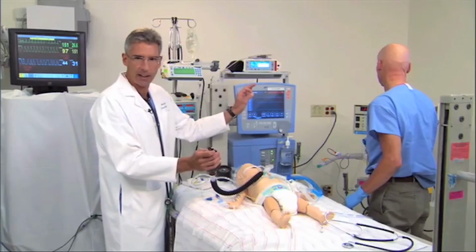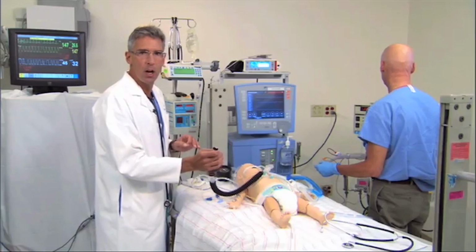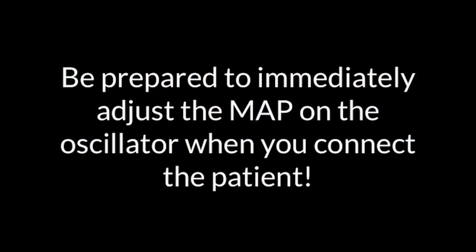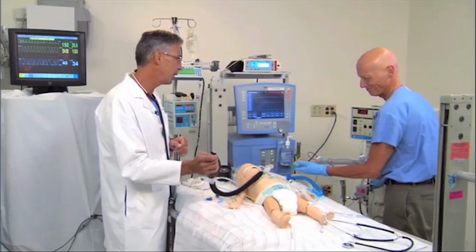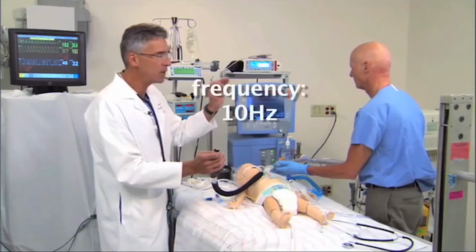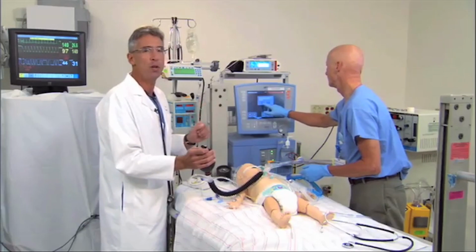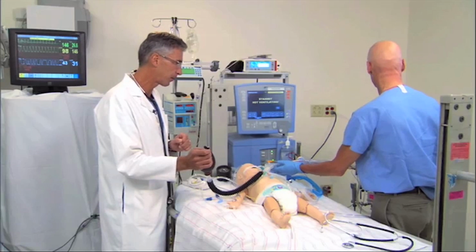Now remember, you can set the ventilator up, but as soon as we connect the patient, the settings are going to change because this ventilator is load dependent in large patients. So be prepared to immediately adjust the mean airway pressure following connection to the oscillator. Barry's doing that now, 23.4 centimeters mean. We're going to start with a frequency of 10 hertz. For a patient this size, typically, we begin with 10 hertz. We may decrease the frequency subsequently, but 10 hertz is where we would start with a patient around a year of age.